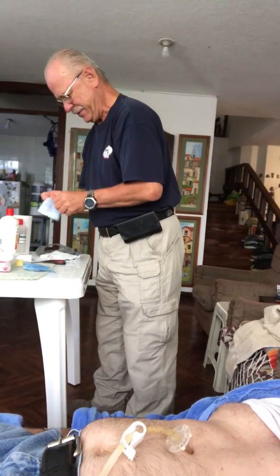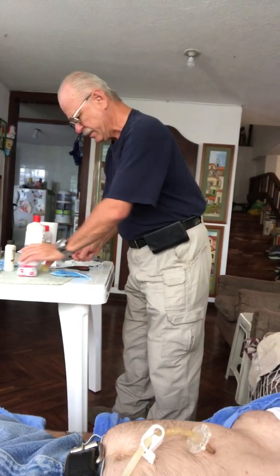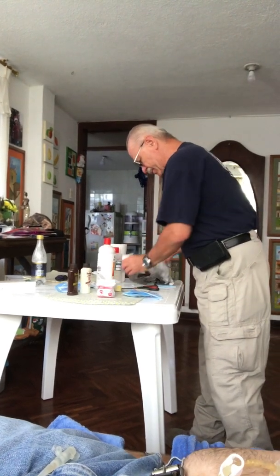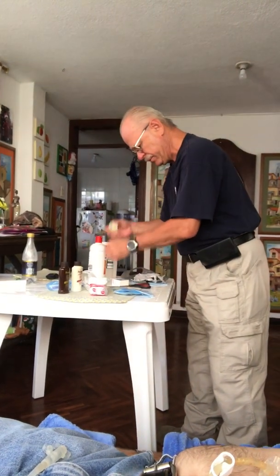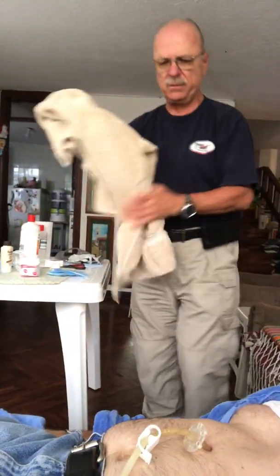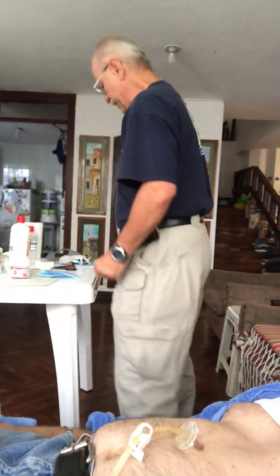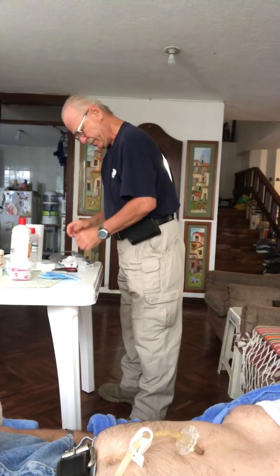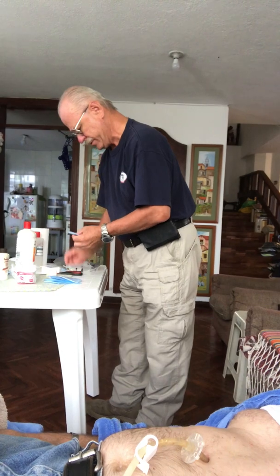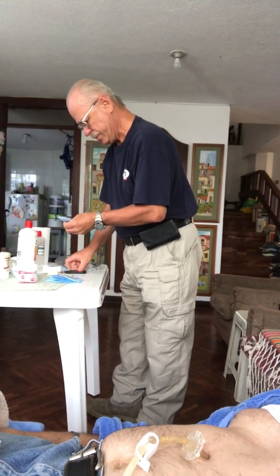Gut shot. So I'm prepping the gauze, prepping this, prepping the betadine. I'm going to glove up. We have the tape. We have the towel. Where's the towel? Here's the towel. I want you to keep that over here just in case. We have enough gauze? Yeah, we do. Let me get just one more.